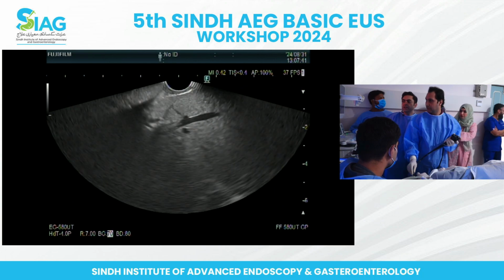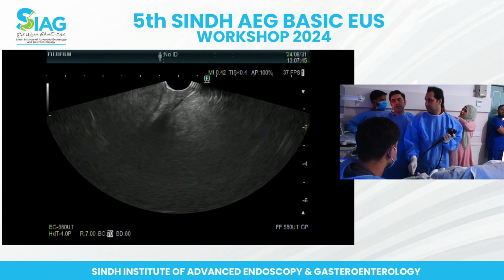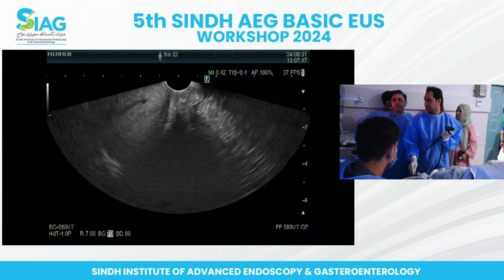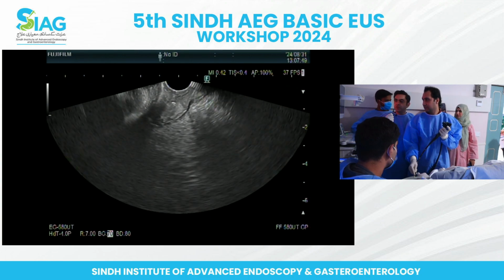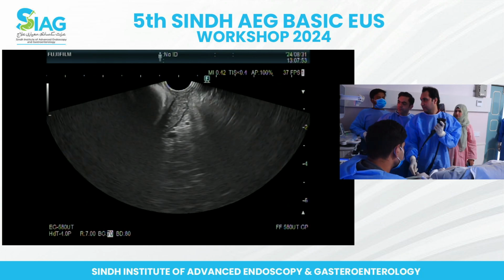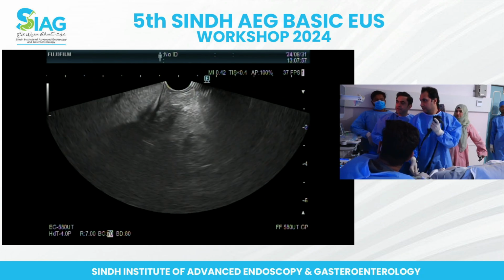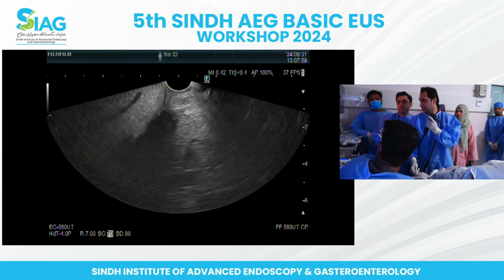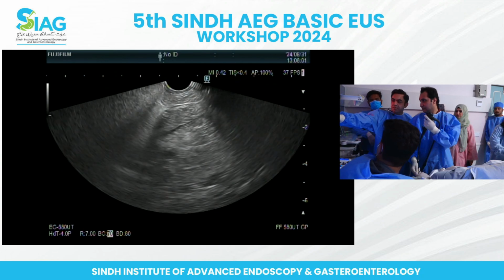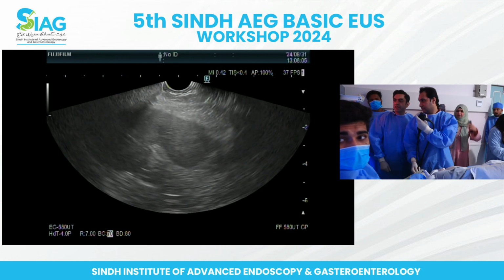Do you want me to pull out a little? No. Keep it there. No pulling out here. So it's not like ERCP. In D1, you actually have a loop in the stomach, so you will be examining it with the loop. Your aim is to find the portal vein, which will be another structure coming from the opposite side and down, with a landing pattern.